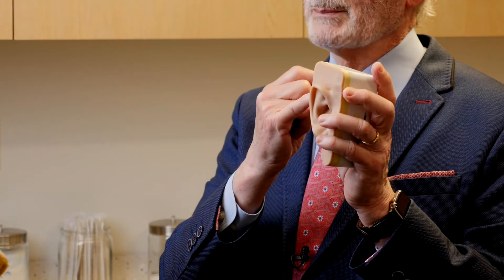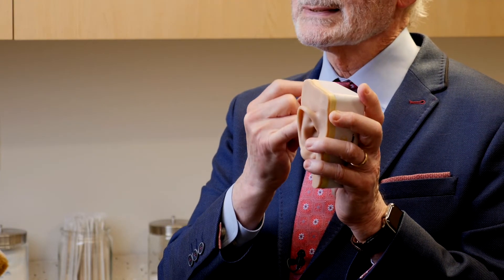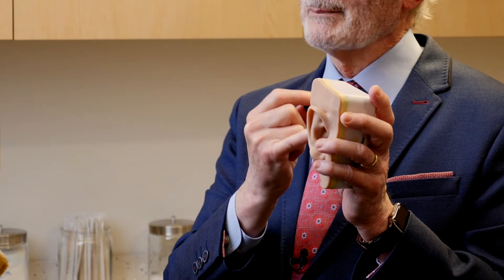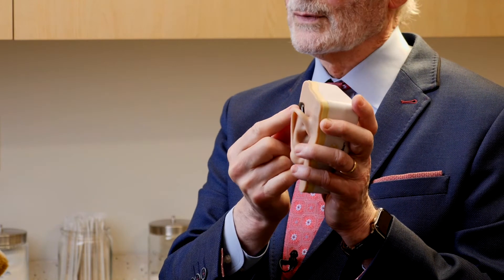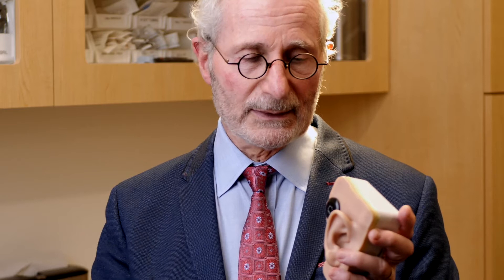Rather than use the abutment, one can place the implant in the bone and place a magnet under the skin. Then you can place a magnet over the skin, like this, and you can change the strengths of those magnets, and that will hold your bone-conducting hearing aid without anything coming through the skin, so there's less chance for infection.